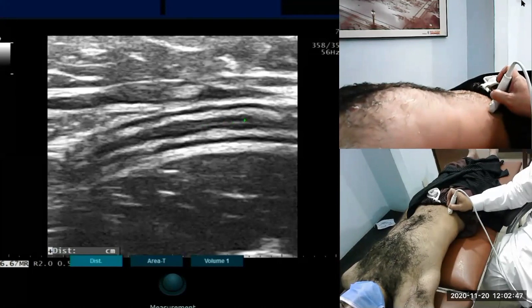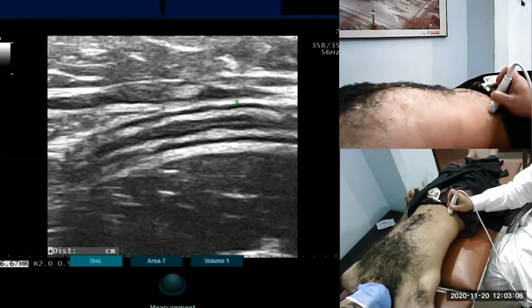The two opposing mucosal surfaces together will make this white line. On both sides is the mucosa. On either side, you see this submucosa, the white. Then is the proper muscle layer, muscularis propria, and then is the serosa, the white. So how many white are there? The luminal surface is white, the submucosa is white, the serosa is white. This is muscularis propria, and this black is the mucosa.